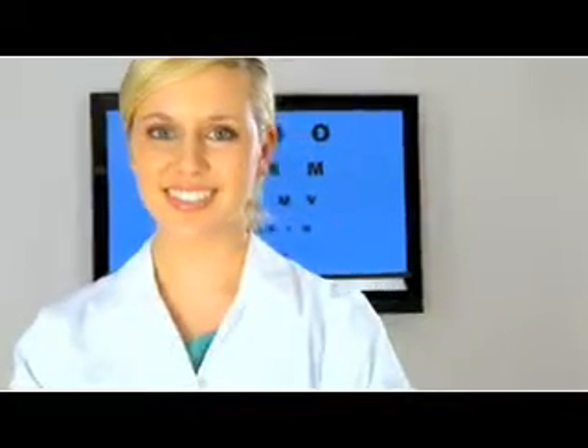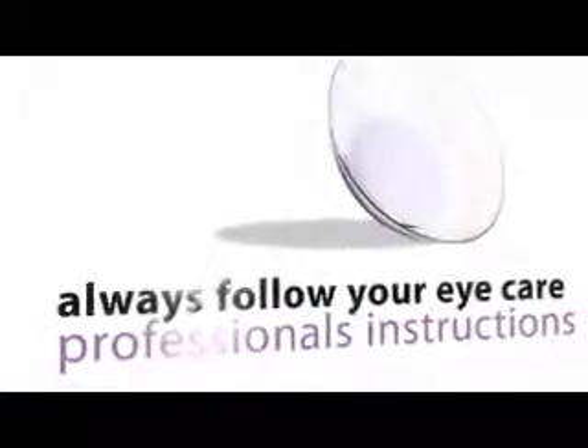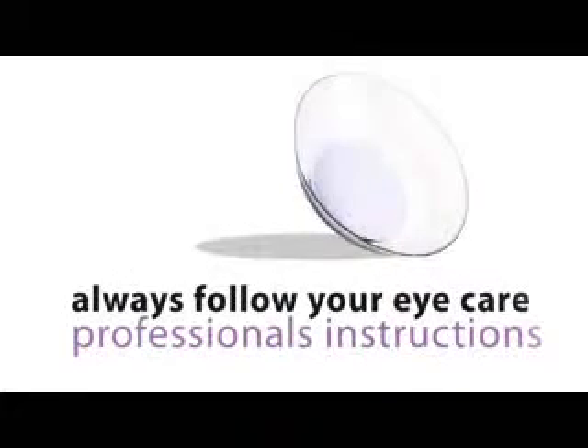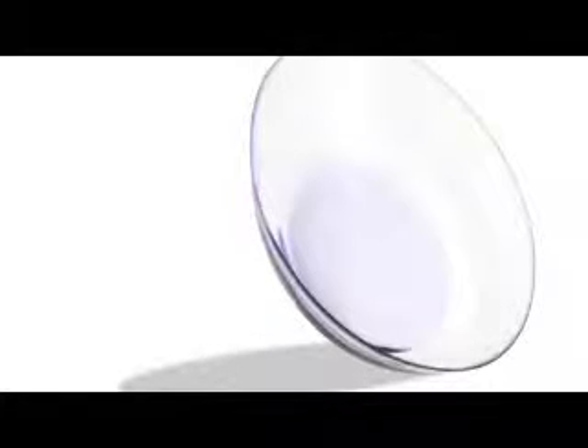This video is meant to be a guide to teach you how to be successful with your lenses. It is important that you always follow your eye care professional's instructions. Based on your individual needs, your eye care professional may recommend special procedures not covered in this video. Your hybrid lenses come with a lens handling tint so that they are easy to see and handle. This tint will not affect how you see or how your eyes will look.